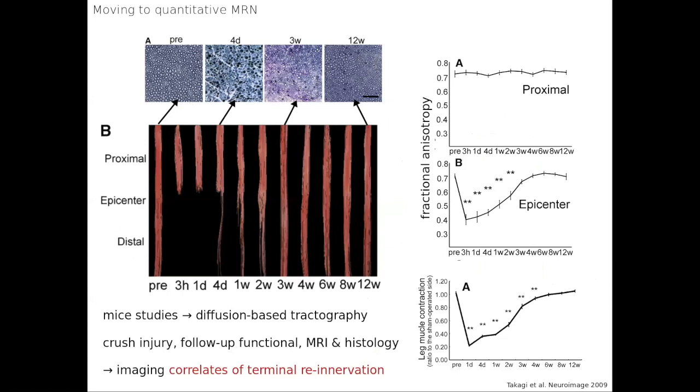Not only the morphometric data can be interesting to assess quantitatively, but also the diffusion processes within the peripheral nerves.